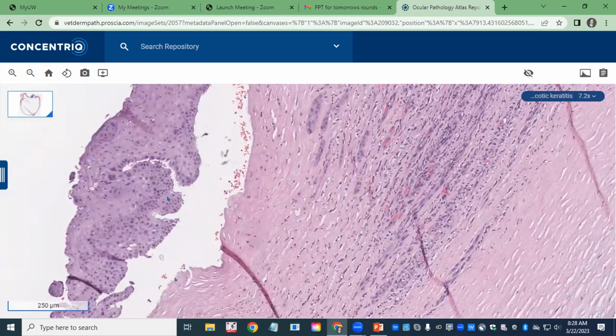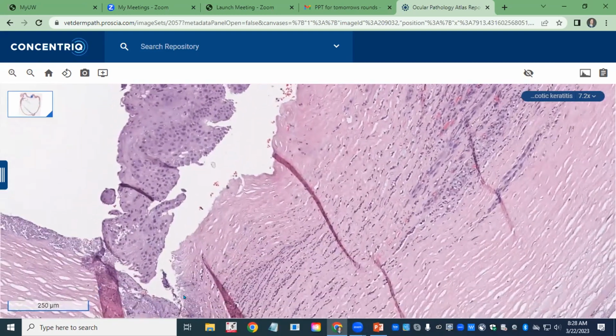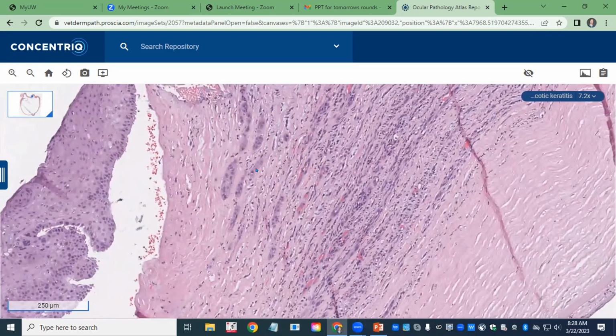And if the epithelium were intact diffusely in this area, like all the way across this area, it would simply be a subepithelial cleft. And if it is torn, as it is here, then it's actually classified as an indolent ulcer, because then all of a sudden the epithelium is absent in an area, hence the term ulceration.